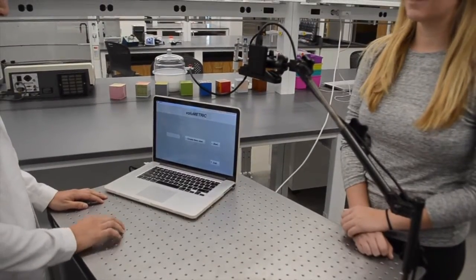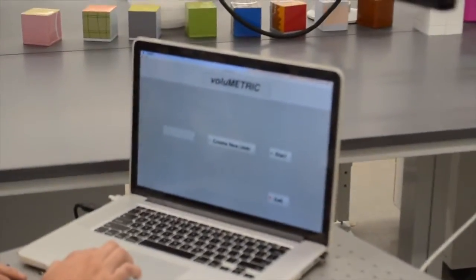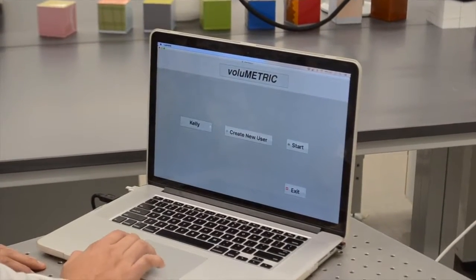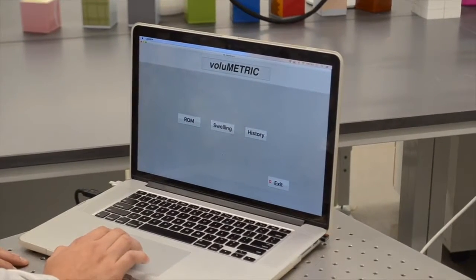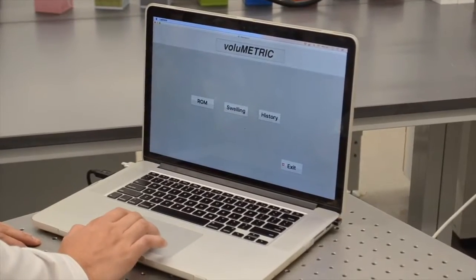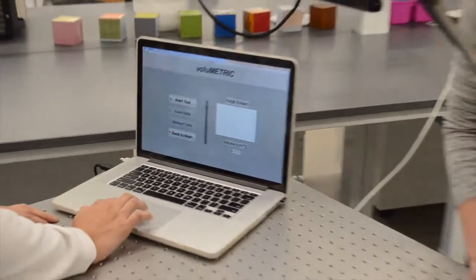voluMETRIC uses a simple user interface to reduce the barrier for patients to use the system. In this case, Kelly wants to perform a swelling test on her recently operated on hand. First, we select the user profile. In this case, it's already been created, and now we can start the test. Here, she has the option of either choosing range of motion or swelling or viewing her existing history. But in this case, we're going to go to swelling. Now, we can start the test.